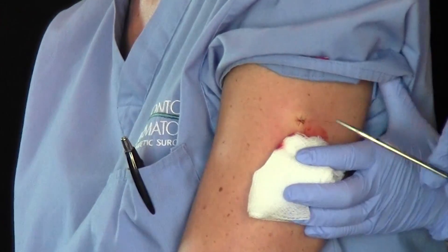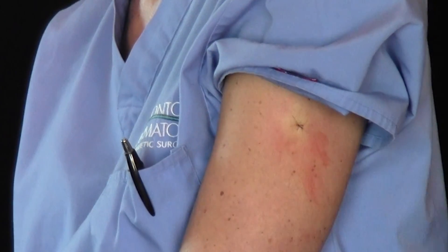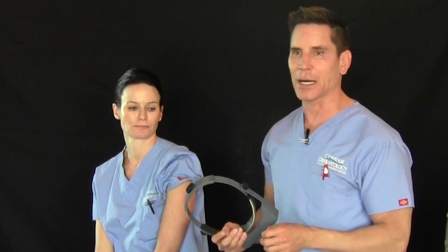Let me go ahead and cut. After this, what we'll do is dress it with a little polysporin and put on a band-aid. We'll clean it once or twice a day with soap and water, put on polysporin, and then apply the band-aid. As mentioned, the suture will come out in 10 to 14 days for the body.